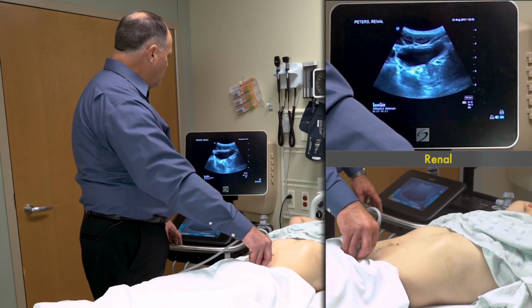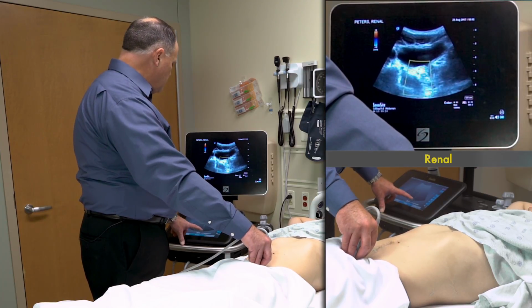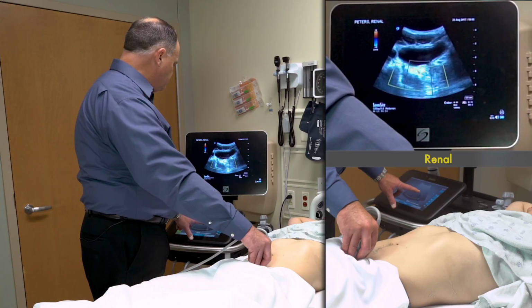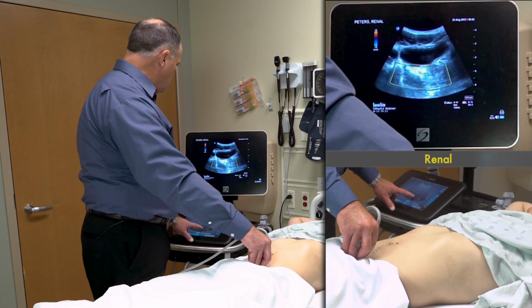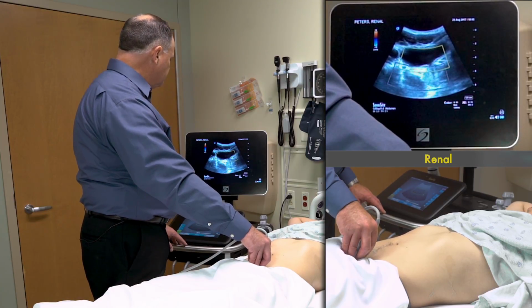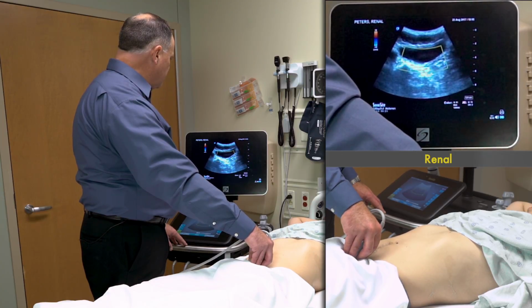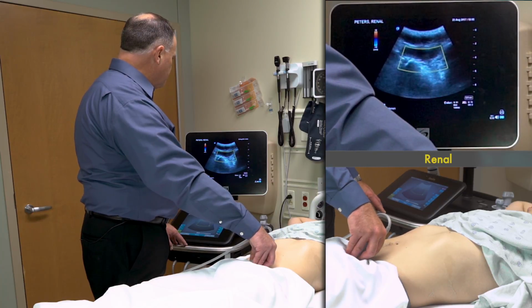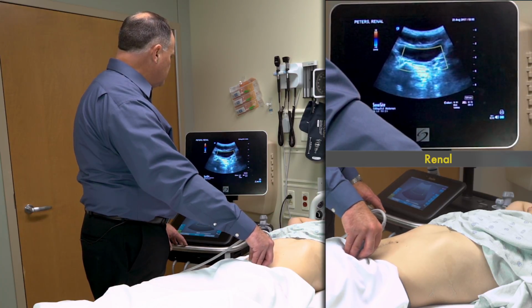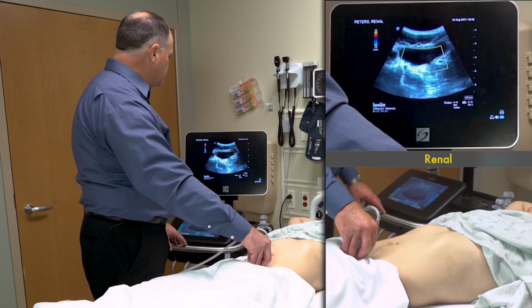Sometimes you can identify where you should be looking by turning on color Doppler. By doing that, you can identify the urinary jets and the production of the urine, and it gives you a better idea of where to fixate your eyes if we can pick up a jet. It can take up to 5 minutes sometimes to find a jet, sometimes even longer. So if you have an obstructing stone, you'll see the jet on the normal side. You won't see the jet on the obstructing side.